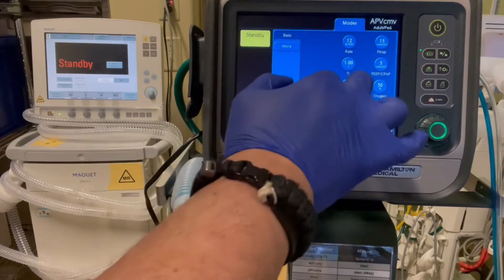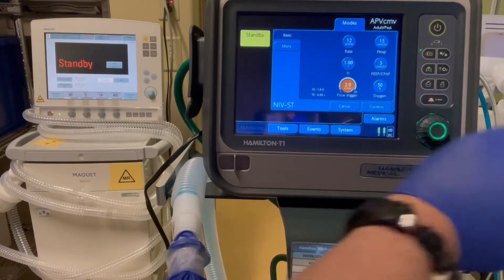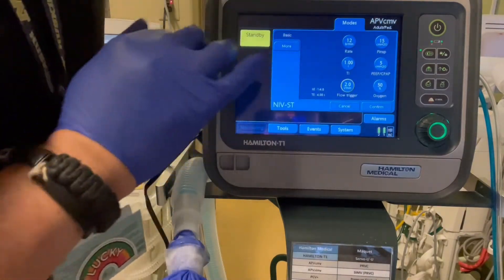Here's our opening screen. First thing we're going to do is dial down the trigger to 2, just so the patient doesn't have to work too hard to get this breath. And you'll see that we have a P inspiratory and a P — and this is going to represent the IPAP and the EPAP in the V60.